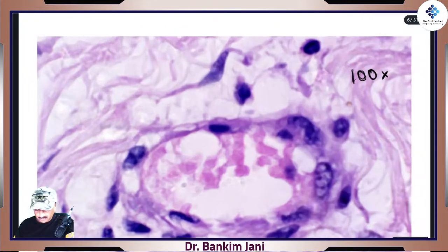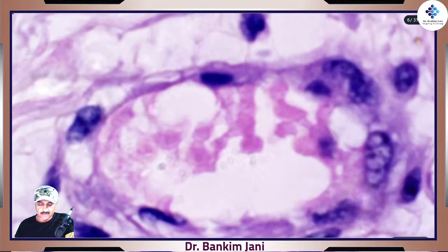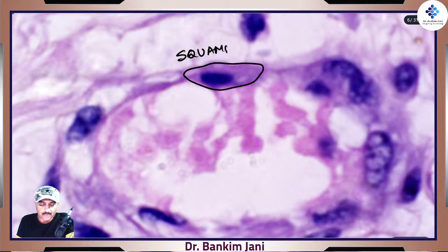Here it is. I am marking it. A classical squamous cell, absolutely classical.